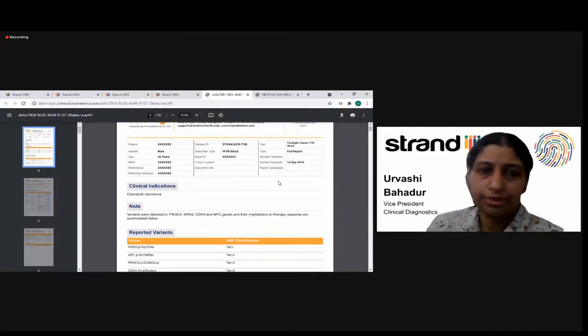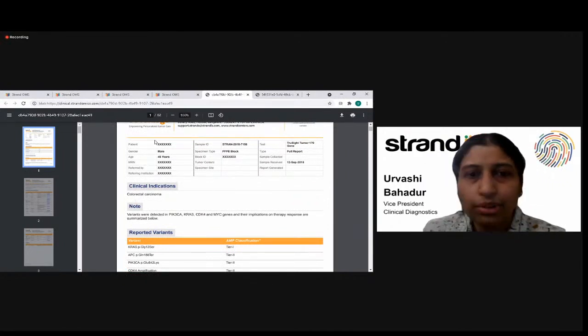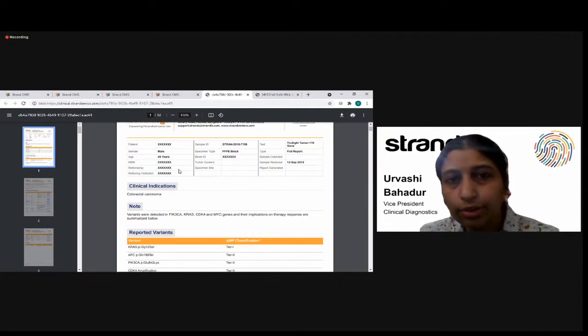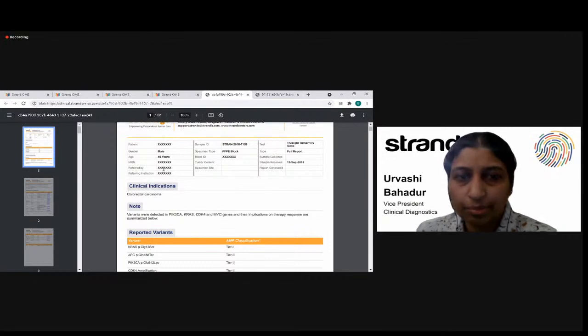And when you look at the report, if you notice now, here is the demographics section. All the demographics that I talked to you about in the first view, those are the ones that are here. And if you notice here, these are all redacted. So StrandOmics is actually HIPAA compliant and role-based access. So in this case, if you enter certain things which are not required for our team to see, except the cancer type and the cancer other details, then we are not going to really be seeing these. And so it's only the person in sign off and at your end who can take a look at all these data. So that makes it HIPAA compliant. So here, these are the things we entered here.